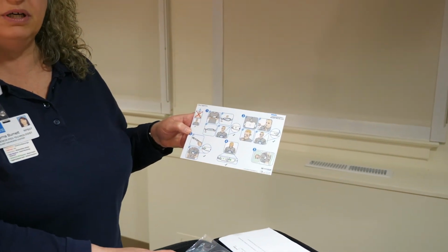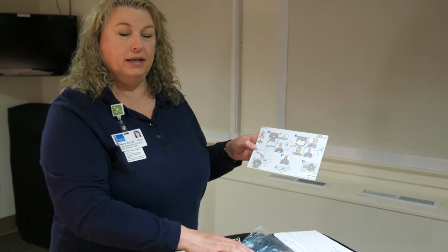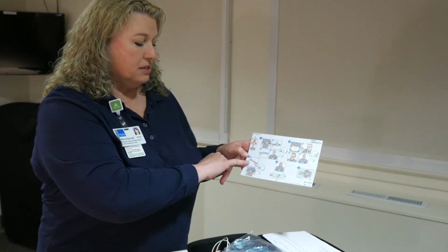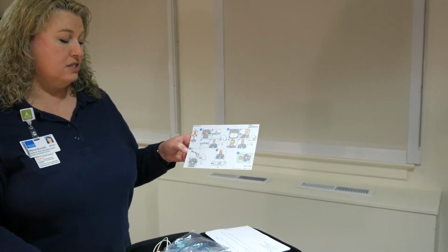It's really important, if you've ever worn oxygen in a hospital before or had someone that has, the tubing does not go over your head. It just goes right up into your nose and around your ears. The third and final sensor is an oxygen sensor. This will go on the tip of one of your fingers, either hand. It will track your oxygen saturation and your pulse tonight while you're asleep.